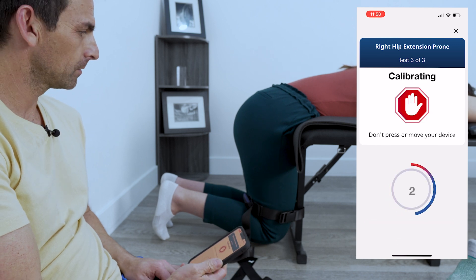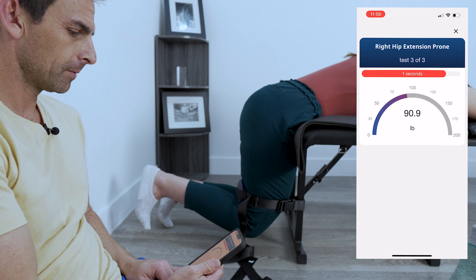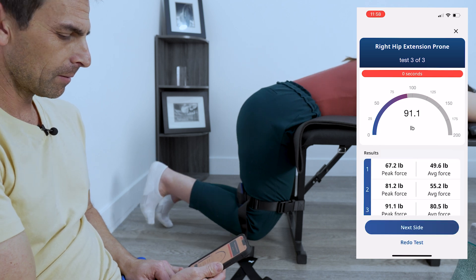Here we go again. Two, one — go, go, go, go, go, go, go, go. There you go. You got better and better.